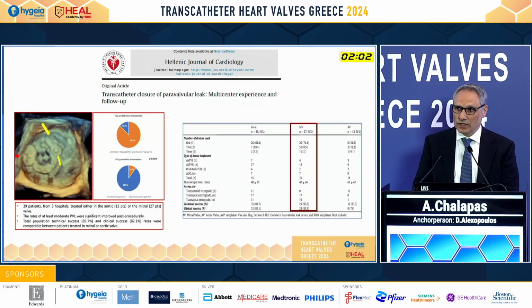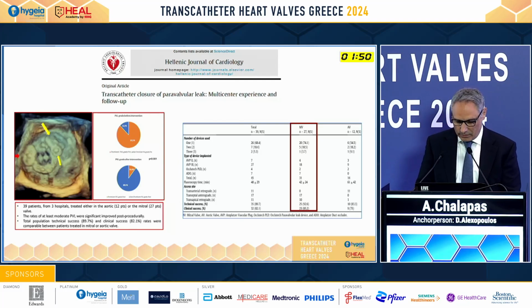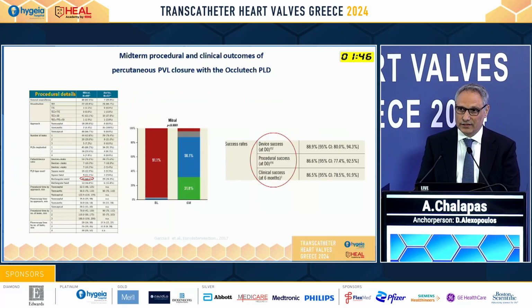Three years ago, we published the Greek data, almost 40 cases for both para-aortic and paramitral defects, showing very high technical success up to 90 to 95%, by using the AVP3 as the most commonly used device.